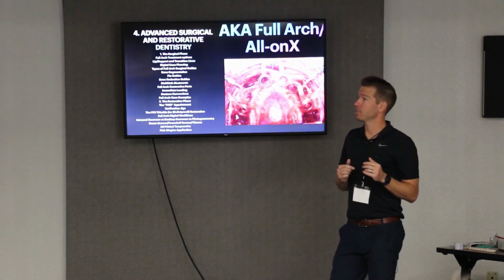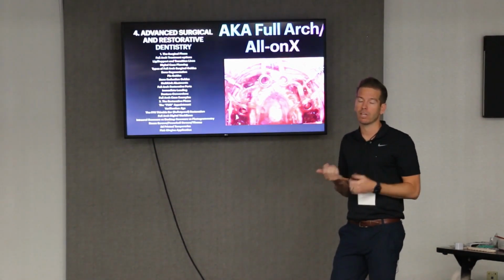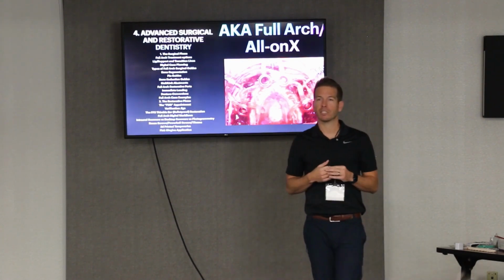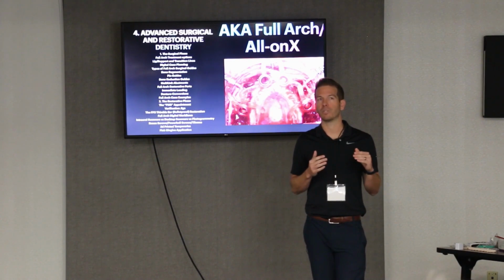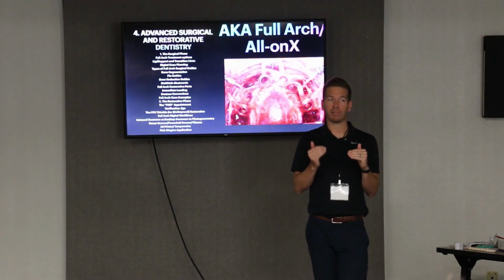I think about most full arch dentistry, most implants that are placed in surgical centers, oral surgeons' offices, it's not guided. I mean, it's freehand, right? And so years of experience can really help with that. But I think there's certain applications of technology that bring that general dentist or that beginner up to that higher level in case planning.